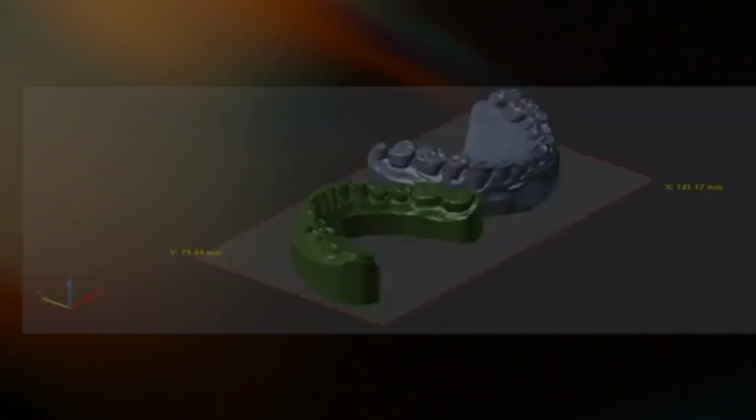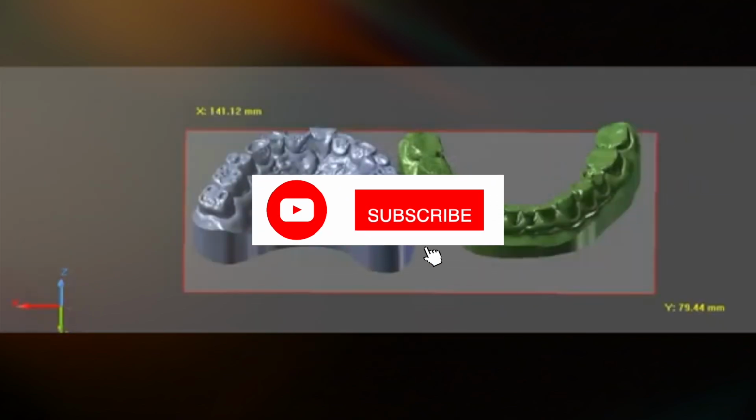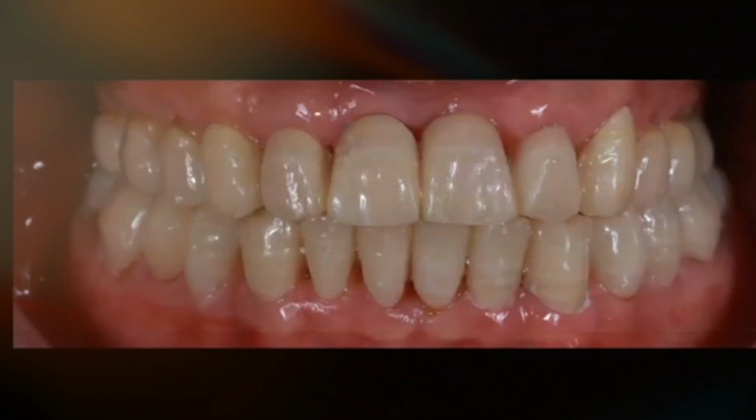Then we proceed to make the first diagnostic models with printing, without any preparation. And then we proceed to make provisionals. These are the acrylic provisionals. It was milling PMMA provisionals without any grinding of the natural teeth.